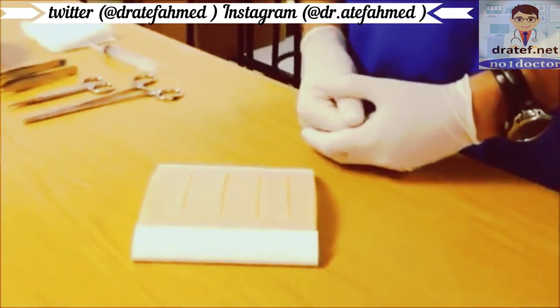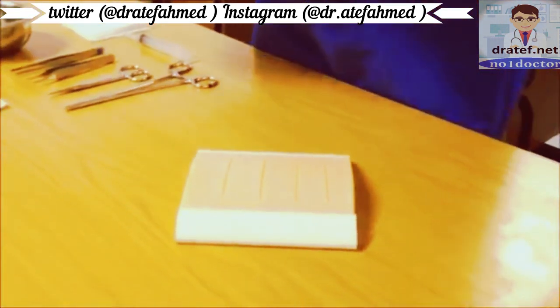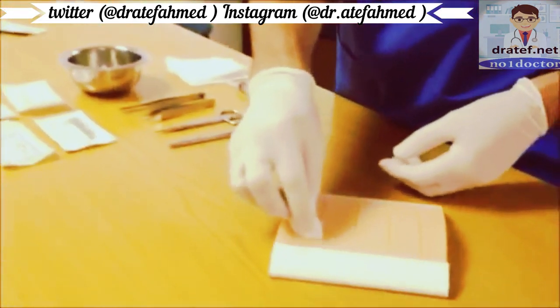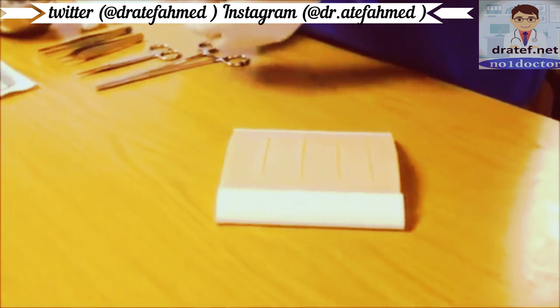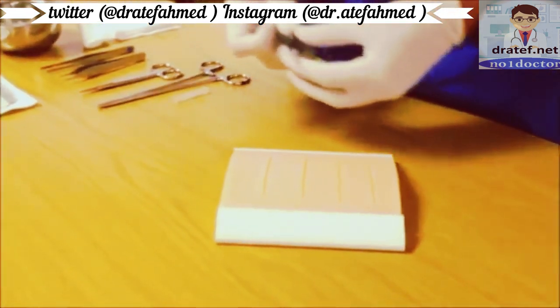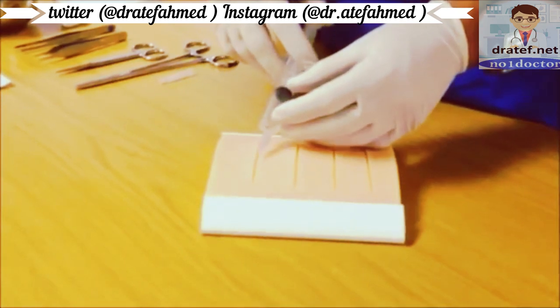After explaining the procedure to the patient, don universal precautions and proceed to gently clean the external surface of the wound. Once this has been done, inject local anesthetic along the wound edges, approaching from the wound side itself and not injecting through the skin.